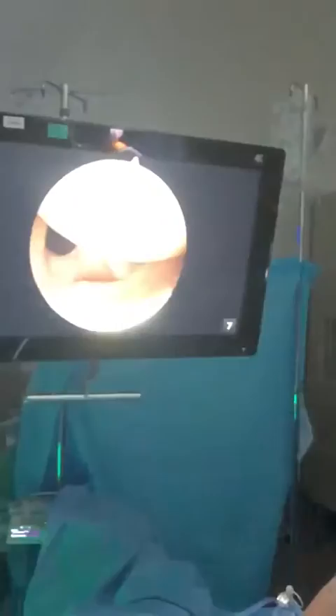And then we're going to go back up top. Here's our bicep tendon going down to the superior labrum — you can see that looks a little frayed. And here's our rotator cuff coming in the front. You can see some partial tearing here of the rotator cuff and then insertion here on the humeral head.